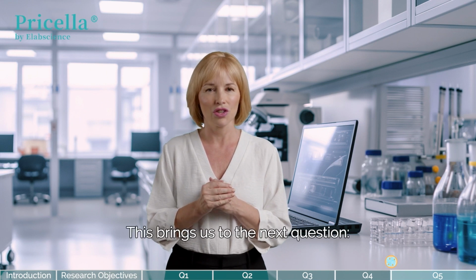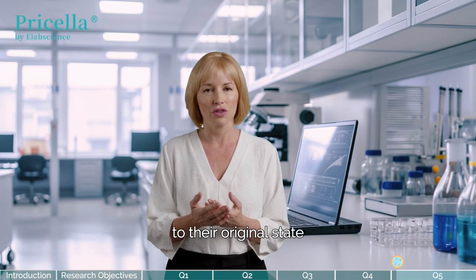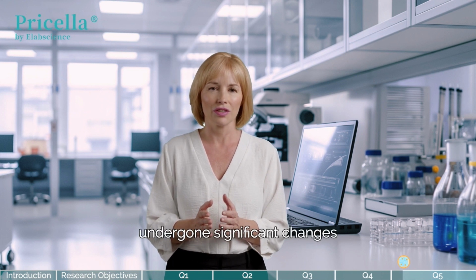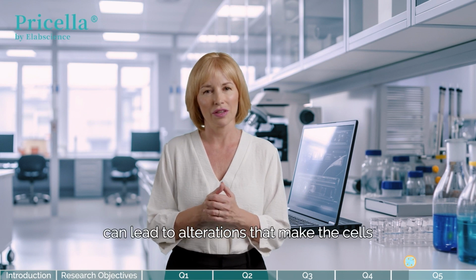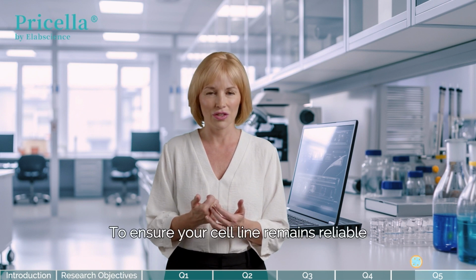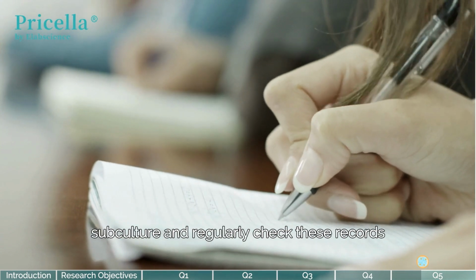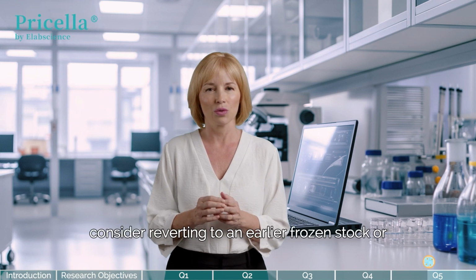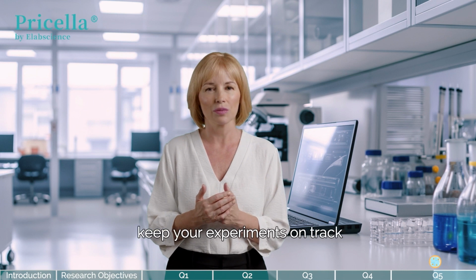This brings us to the next question. Is it low passage? Low-passage cell lines are closer to their original state, meaning they're less likely to have undergone significant changes. High passage numbers, just like genetic drift, can lead to alterations that make the cells less representative of the original tissue or disease model. To ensure your cell line remains reliable, document the passage number of each subculture and regularly check these records. If your cell line is approaching a high passage number, consider reverting to an earlier frozen stock or acquiring a new low passage line to keep your experiments on track.